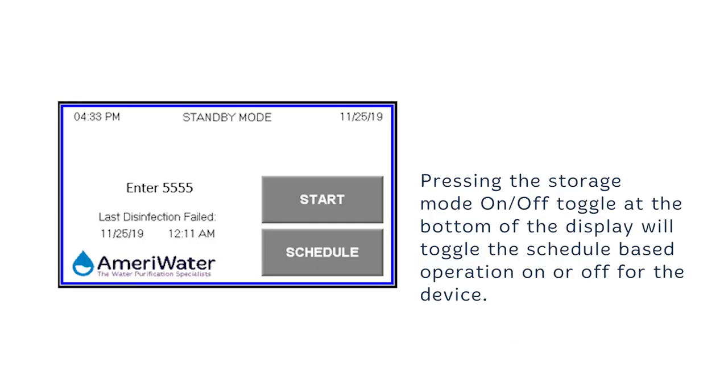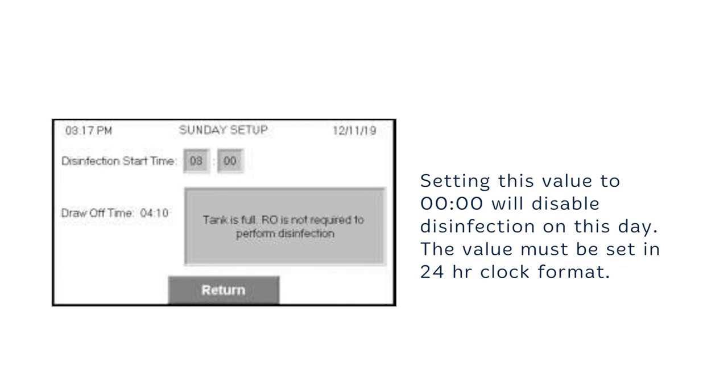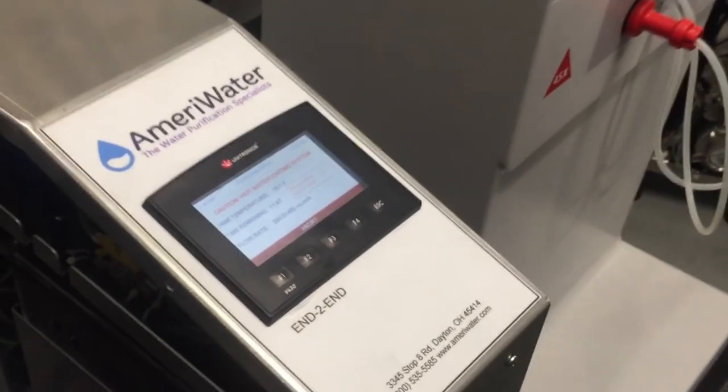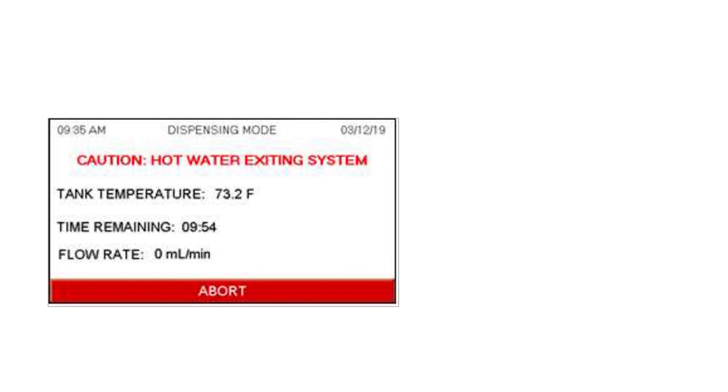To begin an automatic disinfection, first verify that the Centurion Plus tank is full of RO water prior to the scheduled disinfection time. Schedule a disinfection for the desired time; the schedule will be repeated on a weekly basis. At that time, the device will automatically start a disinfection cycle. The HD machine should be ready in rinse mode approximately 1 hour and 15 minutes after the cycle has started. You can abort the cycle by pressing the abort button, which will send the user to an abort confirmation screen. When the abort is confirmed, the user will be sent back to the home screen and the abort will be logged in the alarm history log.